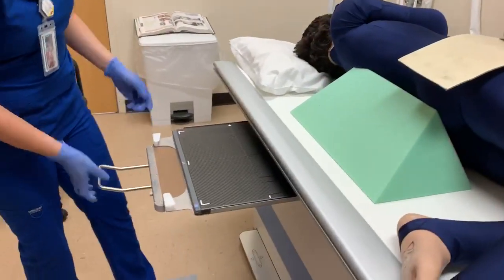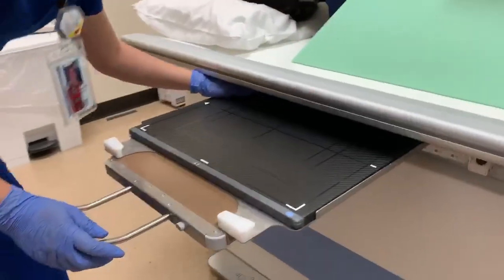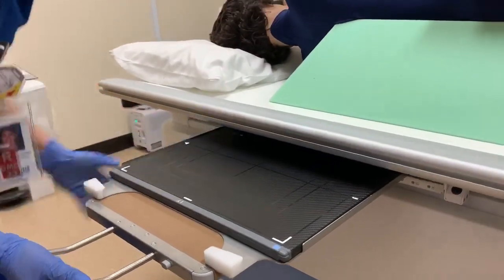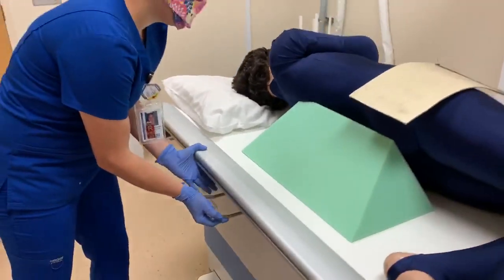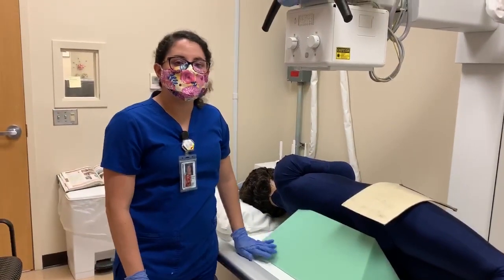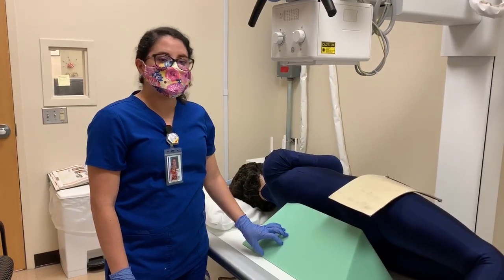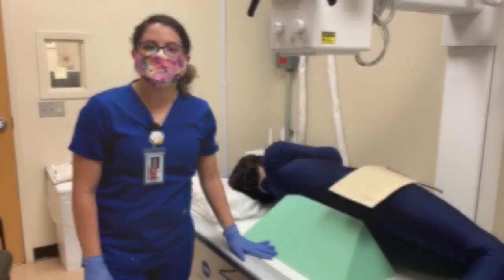We're also going to place our marker. The left marker, so she's laying on her left side. Put it in the upper corner. And our kVp for this position is 90 to 95. We're using center AEC chamber, and at this point we would expose.